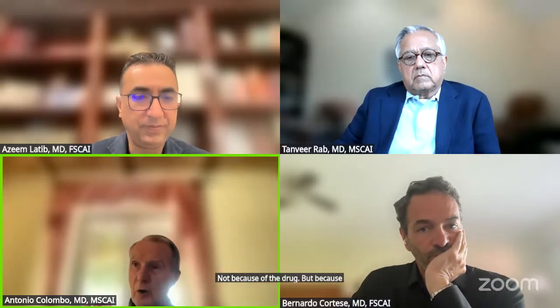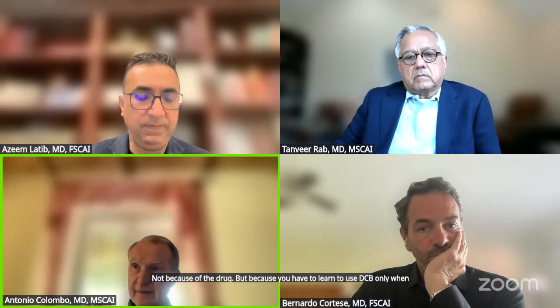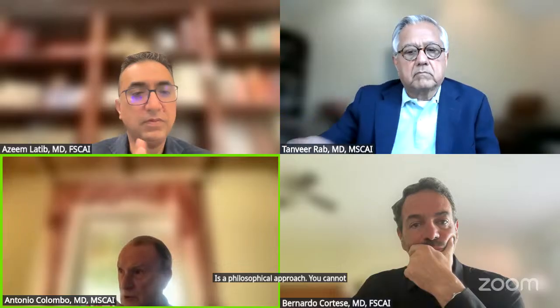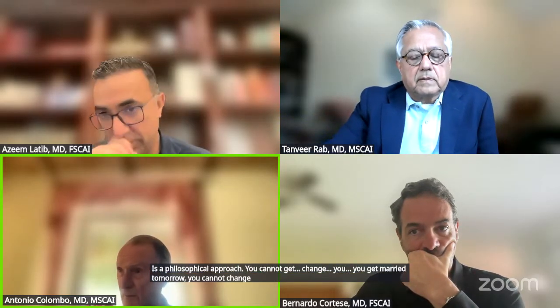But I think you should not do IVUS after DCB, not because of the drug, but because you have to learn to use DCB only when you trust the result. It's a philosophical approach. You cannot change, you get married tomorrow, you cannot change your mind the day before.